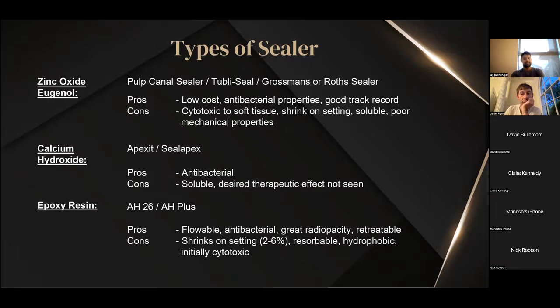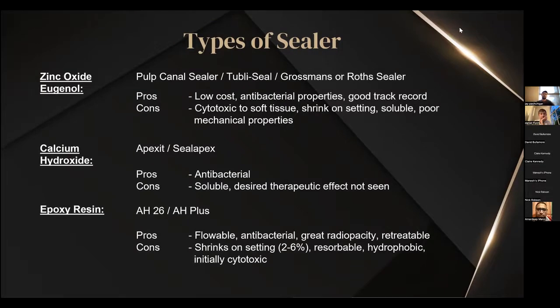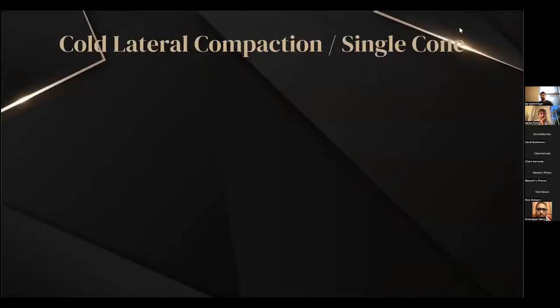The downside to this type of sealer is that they do shrink on setting, anywhere between 2 and 6%. They are resorbable, which sometimes is not really a bad thing. They are hydrophobic and initially cytotoxic. So if you do extrude quite a lot, your patient is likely to have some post-op pain, but they do say it dies down after about a week or so. With the GP, there are a few different ways of getting that GP into the canal.